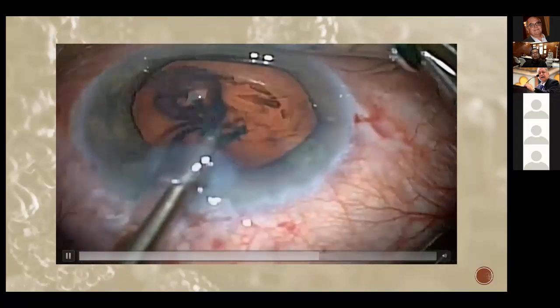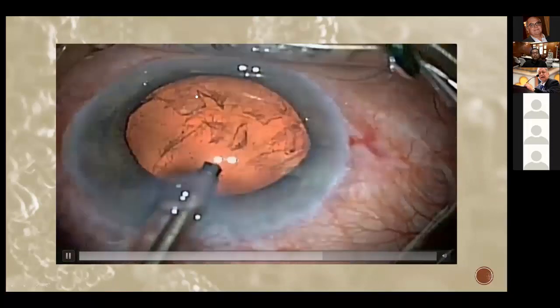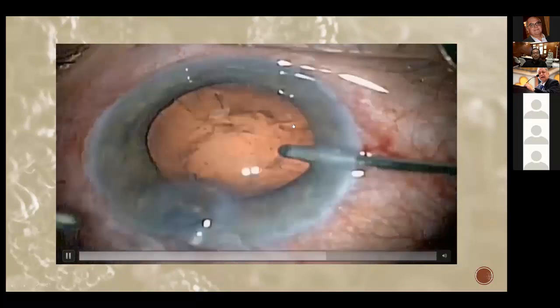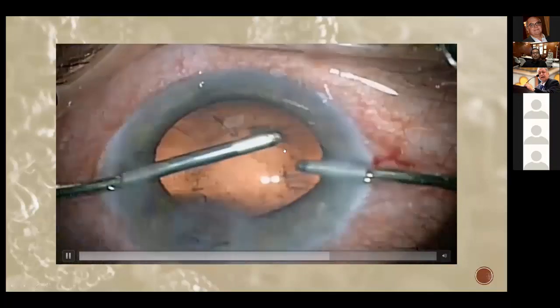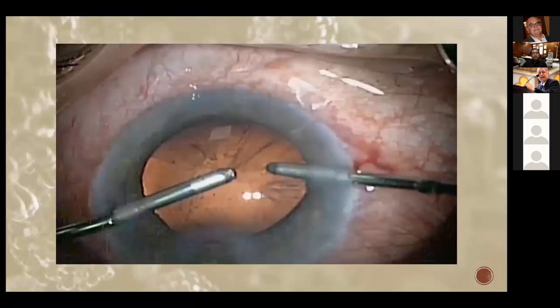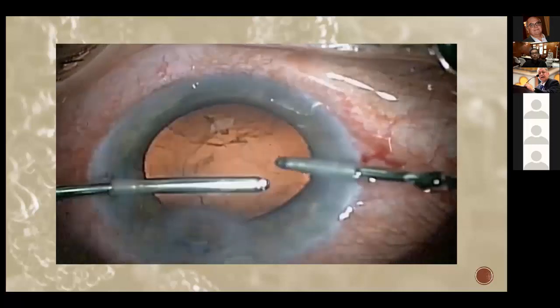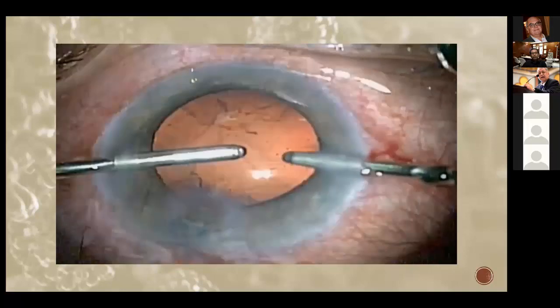And now I'm going to start my IA. And I will show you in the irrigation aspiration what happens when I start. I will not have any problem with the side that I had the positive sign I was looking for. As you can see, I go and IA is easy and no problem. The lens material comes out, the cortex is coming out very easy. No problem. As you can see, it's pulling, no resistance, no dragging.